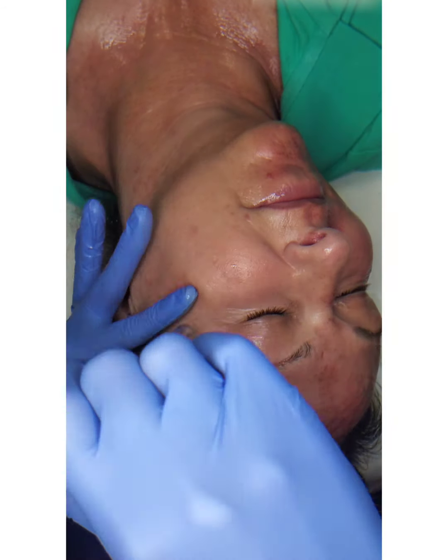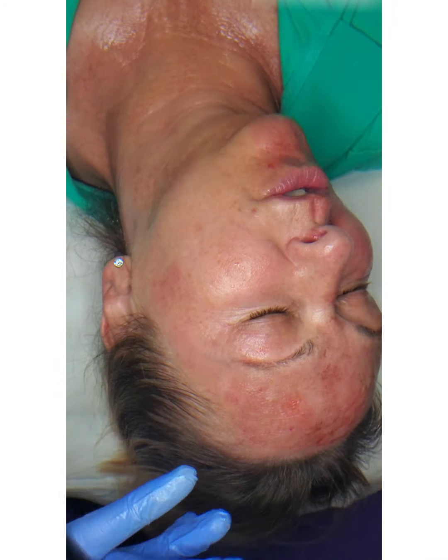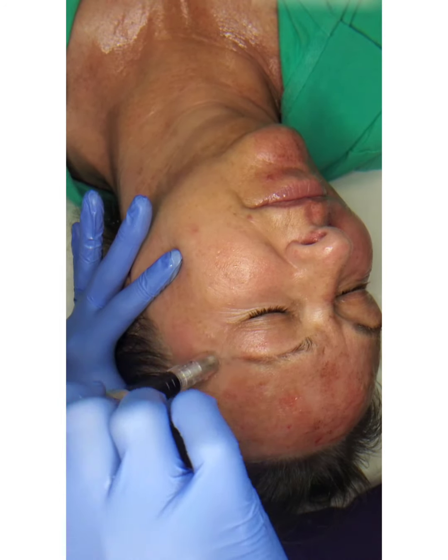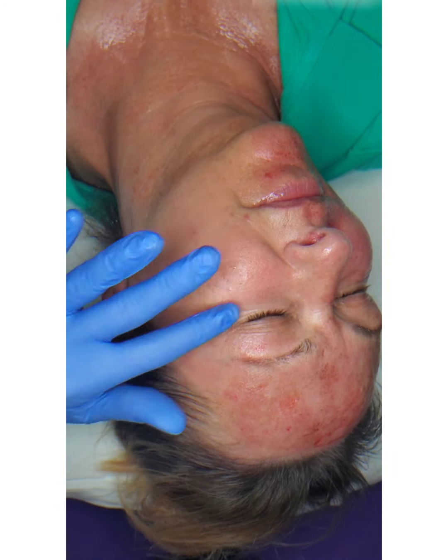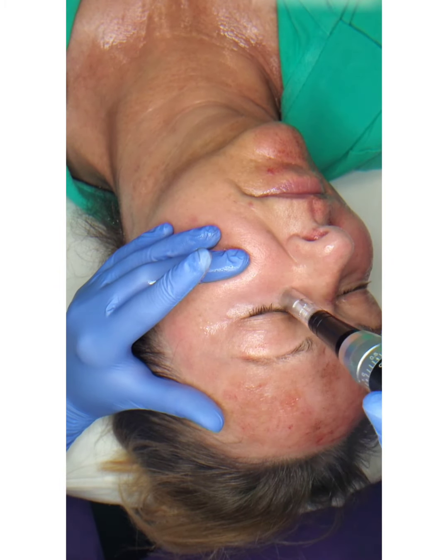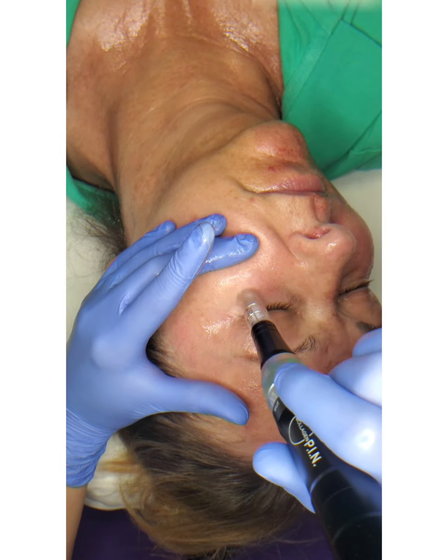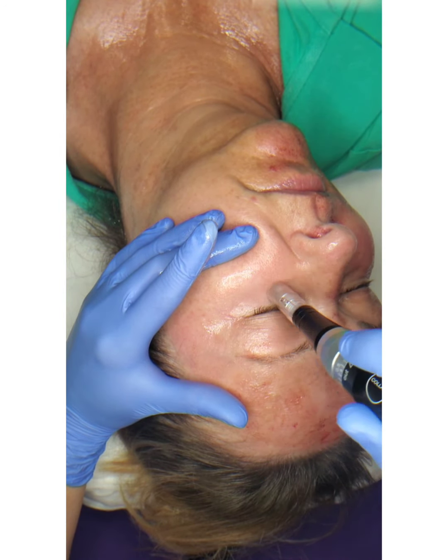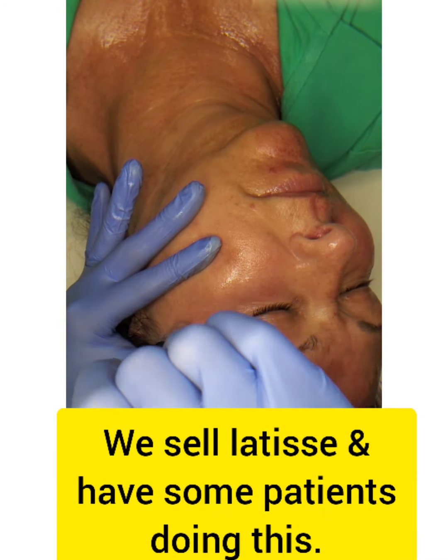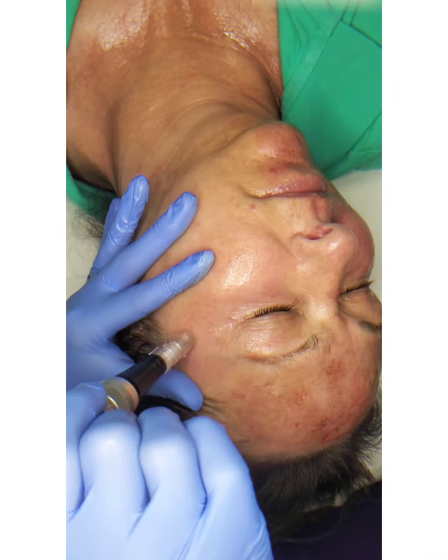So I don't know if you could hear her because the collagen pen is very loud, literally just like a tattoo gun. And she said that she's noticed her eyebrows are filling in a lot more since we have been doing microneedling. That is actually not uncommon. There are people who actually do the eyebrows and then sell latisse with their packages. And if you put the latisse in the area where we microneedled, it will grow hair.